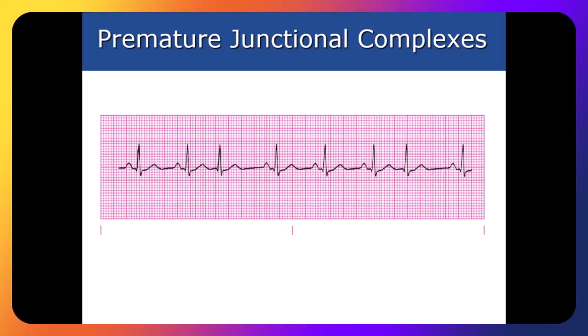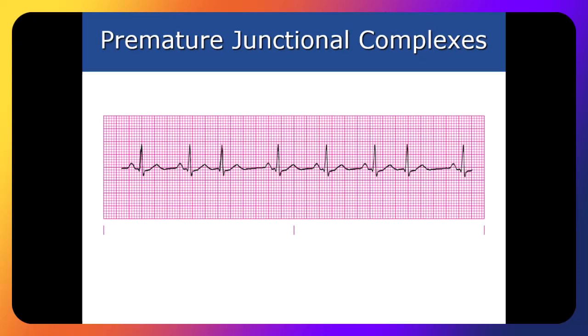Why? Not the P waves that do appear, are they regular? It has nothing to do with the rhythm. It has nothing to do with the rate. It has everything to do with how it looks. So everything on that first one and the second one towards the end, they look almost identical. Okay.